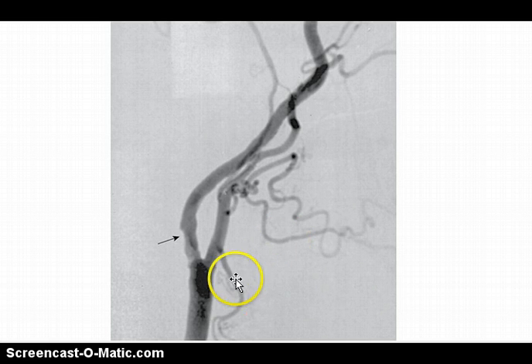Now these images of the common carotid where you can see the bifurcation, that would be considered the extracranial arteriogram, meaning it's not within the cranium at this time. So those are usually centered on the neck versus the inside of the skull. These are centered at like C4, and again, it's mostly to see the arteries as they go up into the neck.